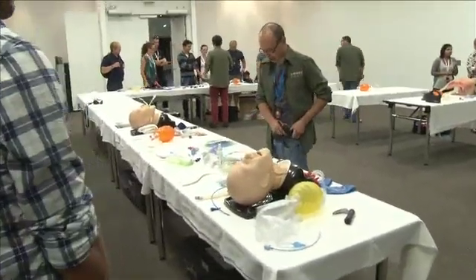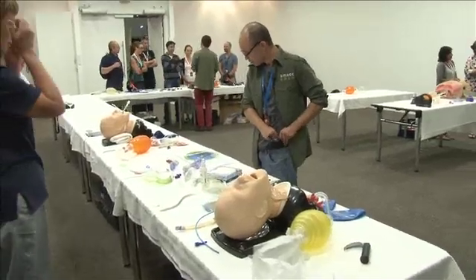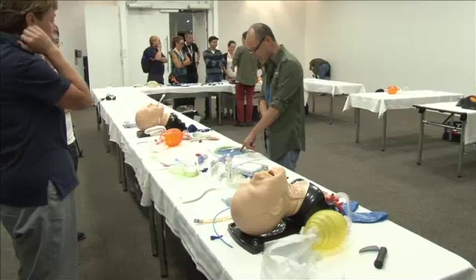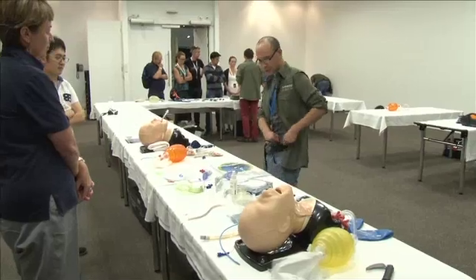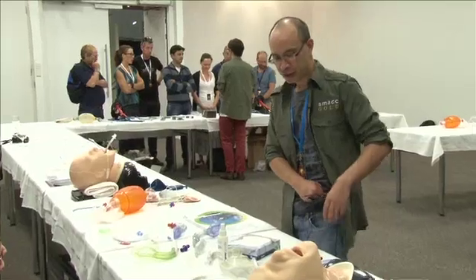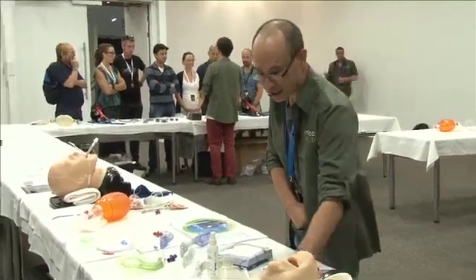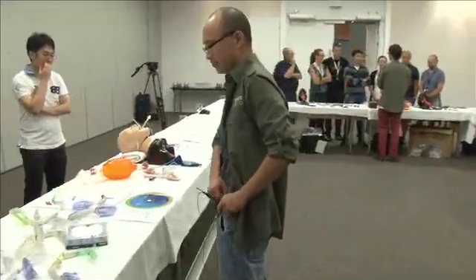All right, guys, so we're doing supraglottic. On the vortex, you would have tried your face mask, you would have tried your endotracheal, and now your last thing left is your supraglottic. So I want you to line up behind each mannequin and show me how you can ventilate the mannequin with an LMA Classic. Let's just get started with that, please.